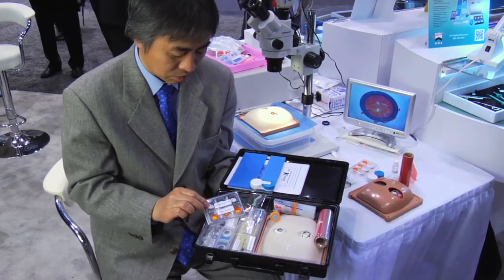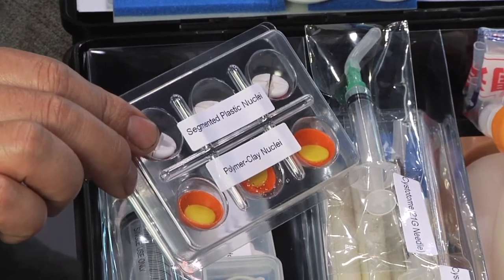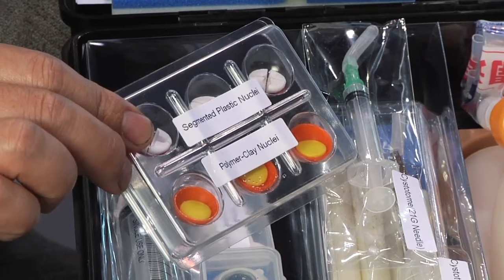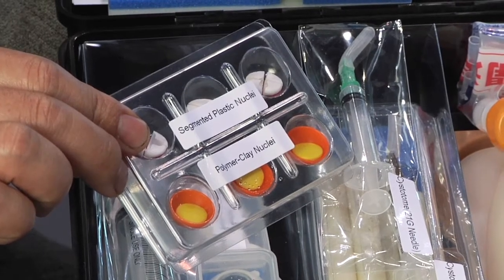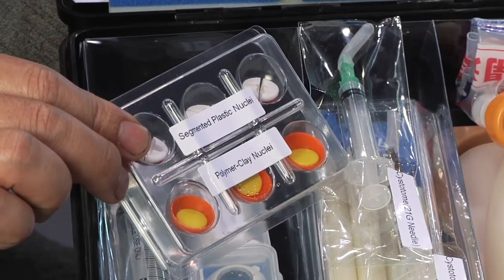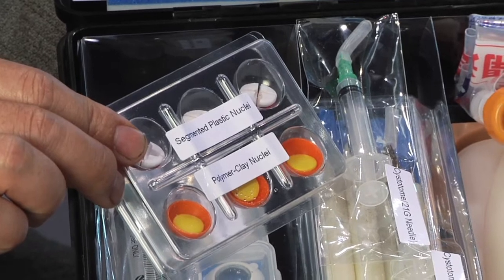Also in the kit are segmented plastic nuclei along with polymer clay nuclei. These are used to practice basic instrumentation and nuclear segmentation techniques like divide and conquer, stop and chop, and phaco chop. After practicing with the segmented plastic nuclei, these same techniques are practiced on the polymer clay.